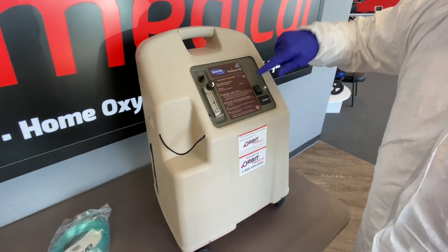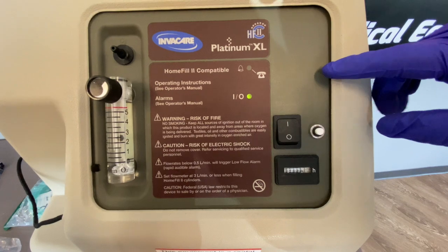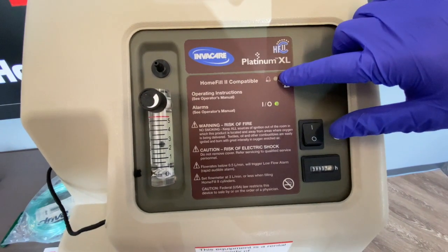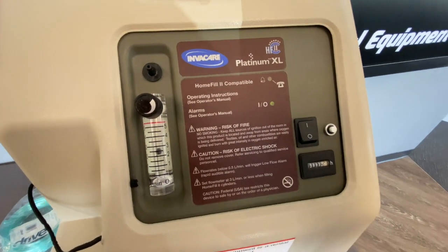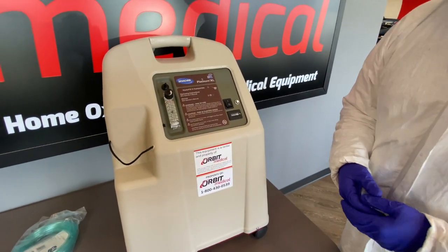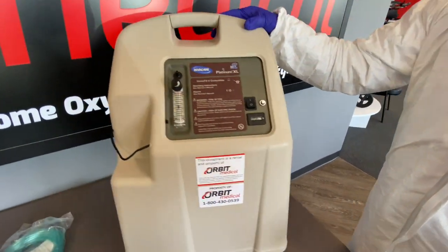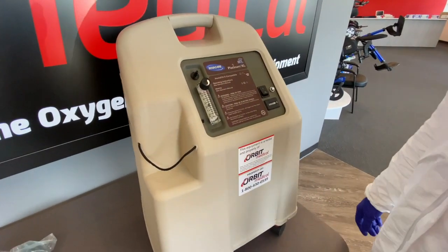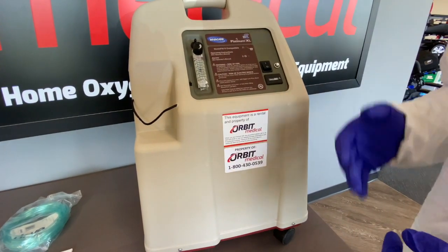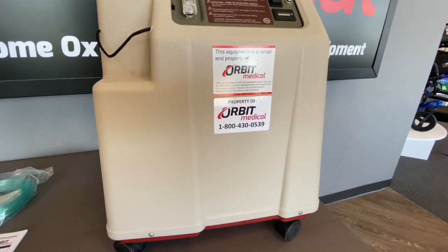Moving back to the interface — the green light is now on. There is also a light that will come on on top if there are issues with your concentrator. Most of the time the concentrator will have a yellow light if the filters are dirty or if you have a kink in your tubing. We want to make sure we're checking both of those before calling the 800 number, but if the light still persists go ahead and call the 800 number so they can send a technician to replace the concentrator.